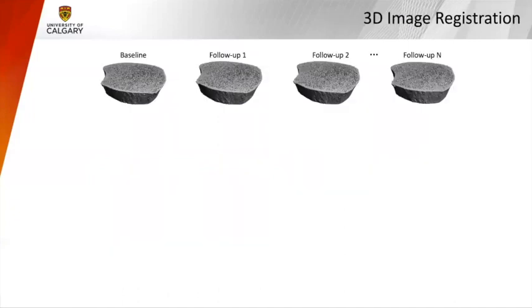So the overall process is described here, and I'm going to whip through it a bit right now and then go back looking at the scripts. If you have longitudinal data sets, and I'm going to use an example where we can have up to n data sets, a specific example where we have 5 scans in the series, what you do is 3D image registration, and you align the baseline to the follow-up scan. The different colors there represent the overlap between the 2 scans.